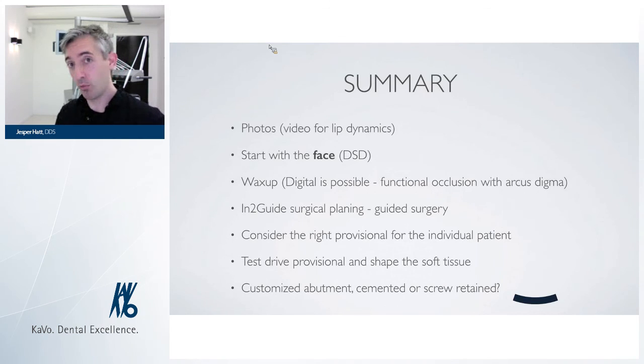Right now, I won't say we're going to do that forever, but at the moment we're using screw retained implant supported crowns on the molars, and we cement everything else on customized abutments on every patient. I rarely use any kind of stock abutment. When I use them, it's only for provisional use.